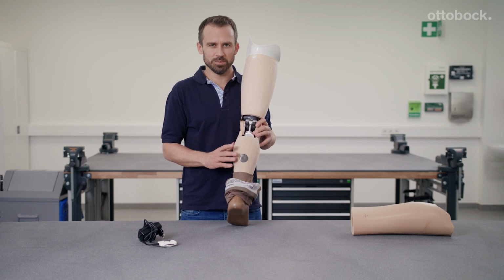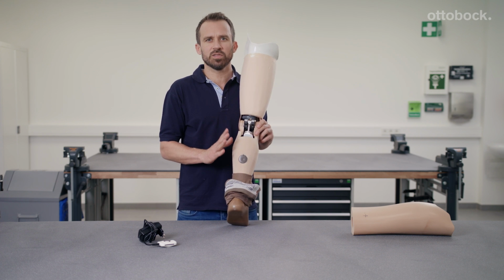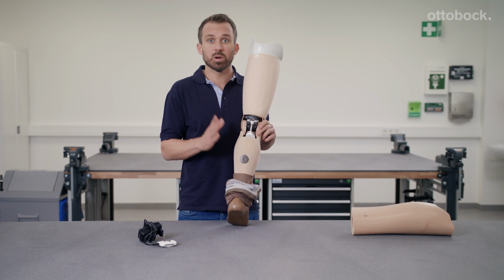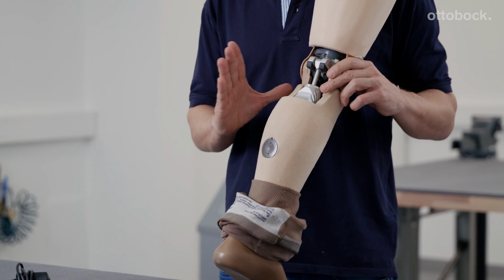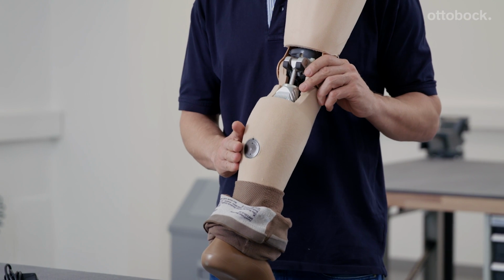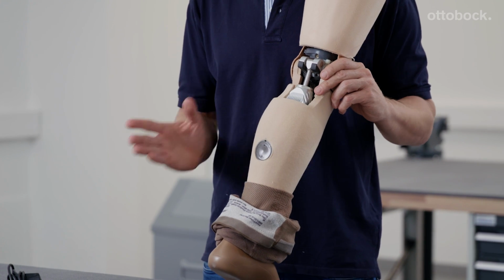A note on the Genium. The leg contour must, as you can see here, be completely flush with the inserted assembly ring. For optical reasons, but primarily so that inductive charging of the joint is possible and the charging unit doesn't get detached. If done properly, it works really well, with or without trousers.